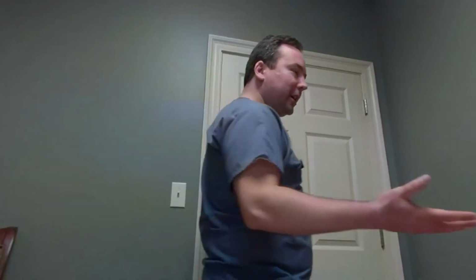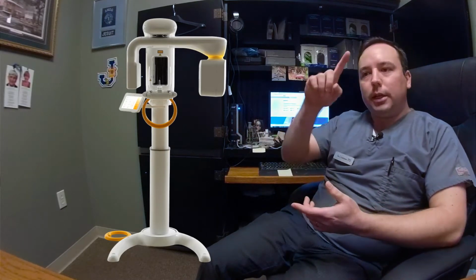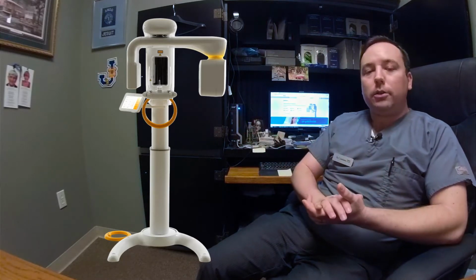Hello again. We are very excited because we just got this new machine in the office. It's called a RayScan Alpha Plus, and it does a couple of things. It looks like our old panoramic machine, which takes a 2D image, and it can do that too. It can also take a CT cone beam, a 3D image.